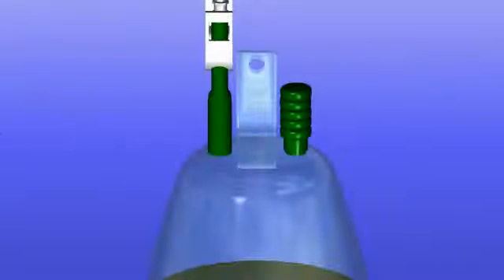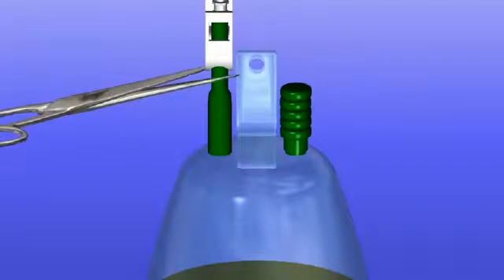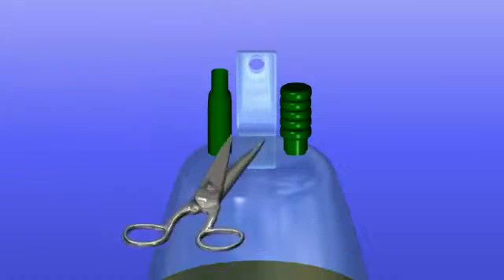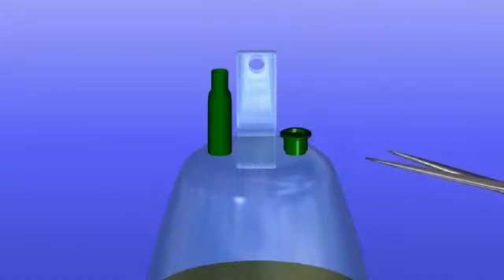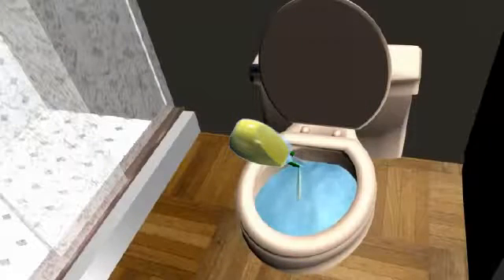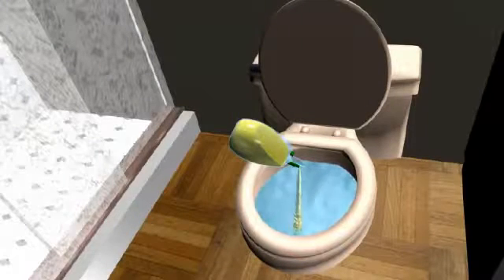Emptying the ASEPT drainage bottle. Take a pair of scissors, cut off the green rubber tube connected to the drain line, as well as the vacuum indicator. Empty the bottle into the toilet. Discard the bottle.